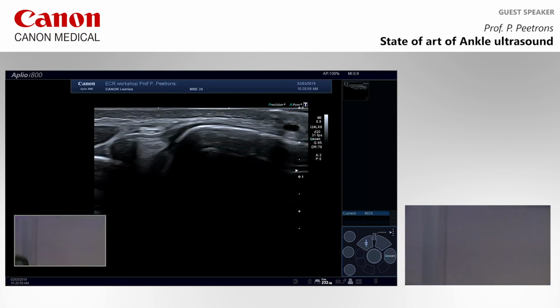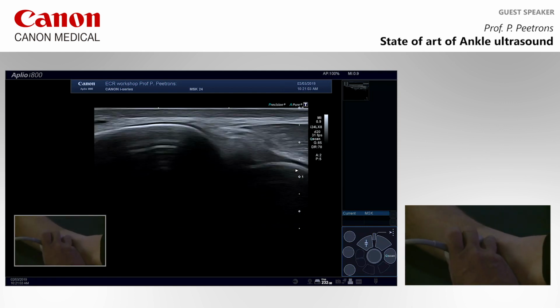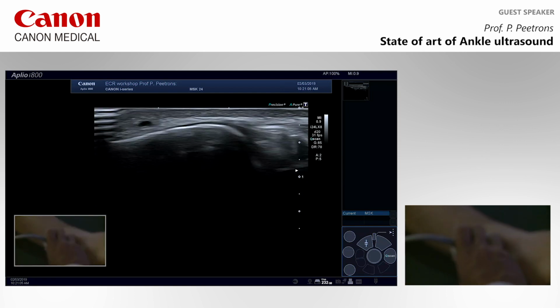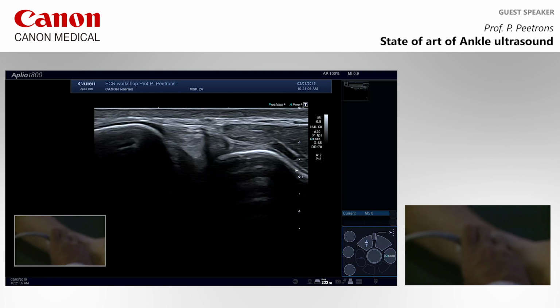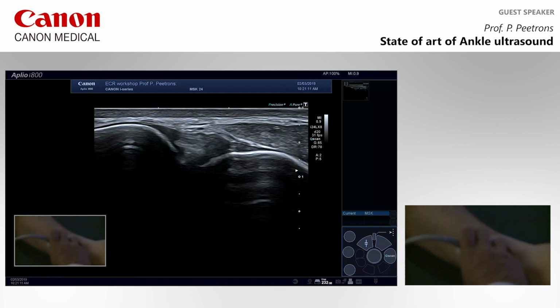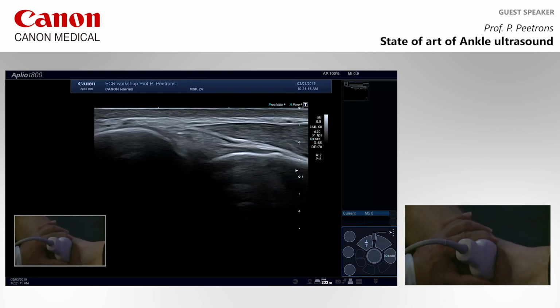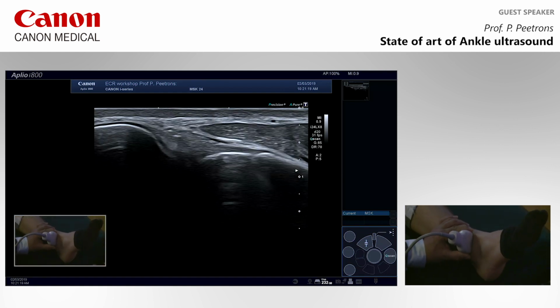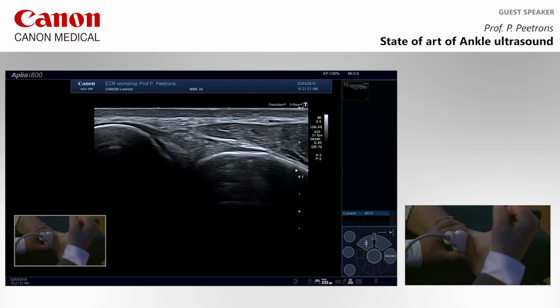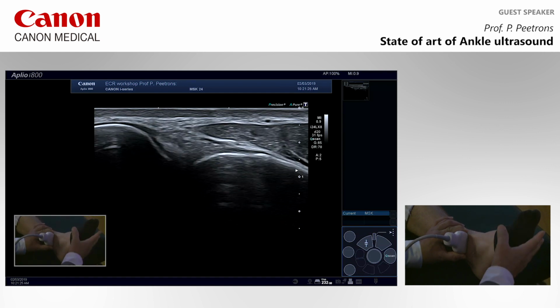So this is the ligament there. I'm sorry, my probe is reversed. So this is the ligament. On the left, I have the fibula. On the right, I have the tibia, and I see here the ligament between the tibia and the fibula. So when I do a dorsal flexion of the foot, I push the talus towards the tibia and the fibula, and it opens a little bit the gap between the tibia and the fibula.